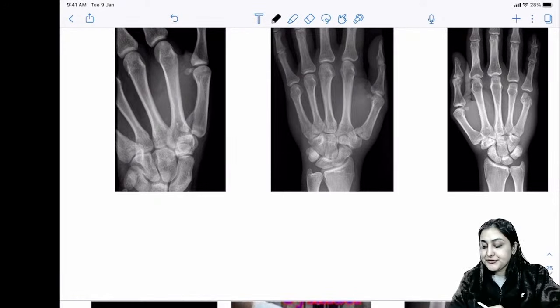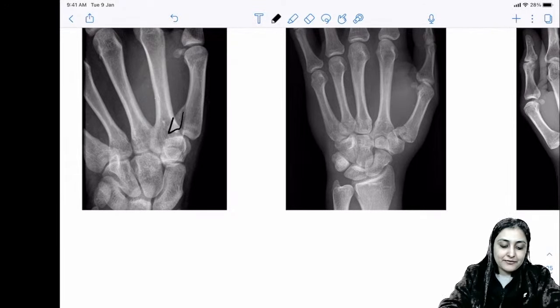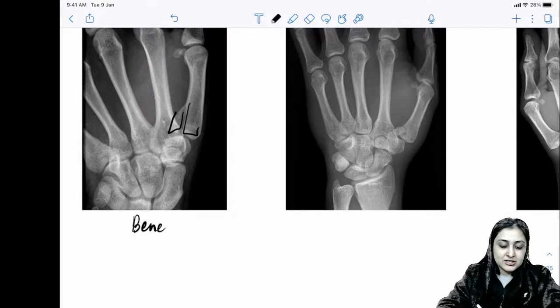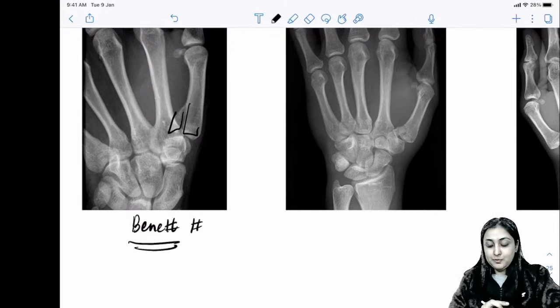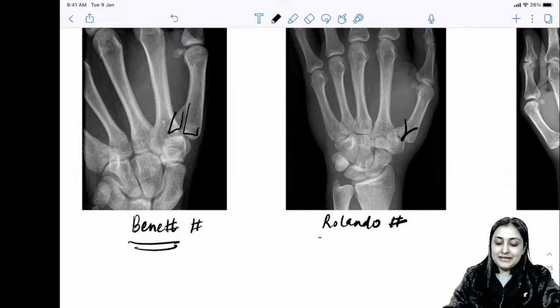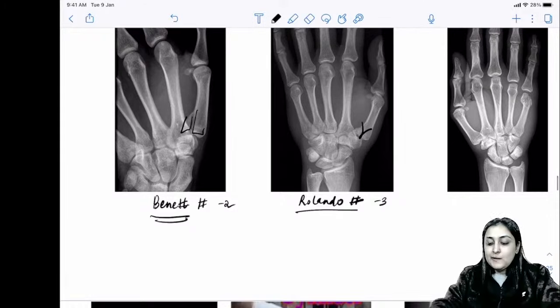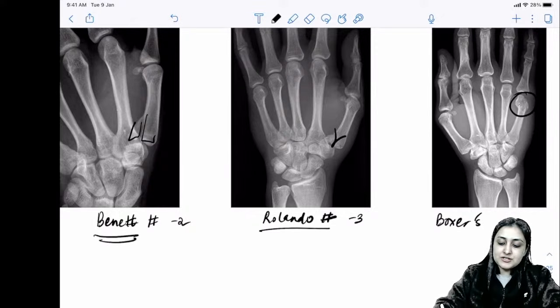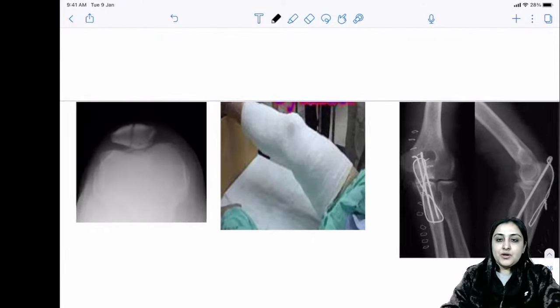Base of thumb fractures: Bennett's fracture-dislocation is a two-part fracture (Gujarati 'be' = two). Rolando fracture is a three-part fracture. Boxer's fracture is fifth metacarpal neck fracture, seen after punching.